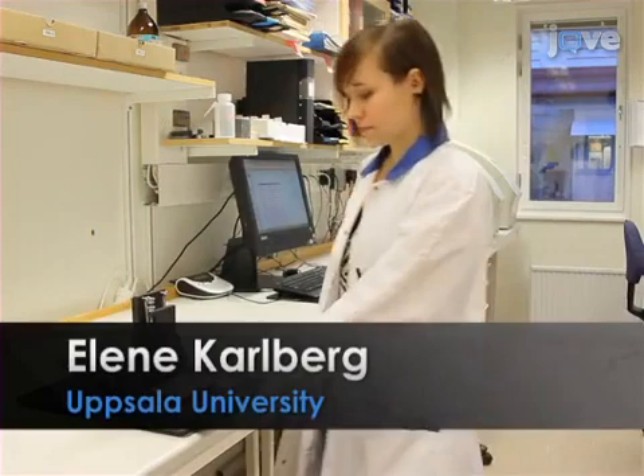Demonstrating this procedure will be Elen Karlberg, a lab technician from my laboratory.